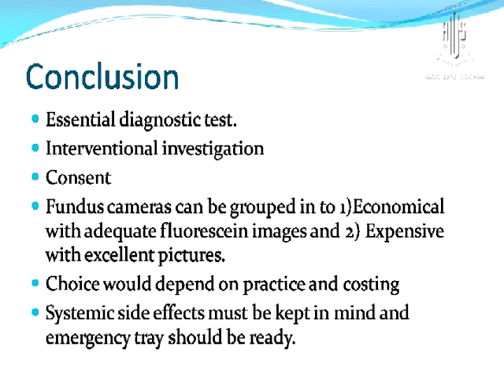So in conclusion, it's an essential diagnostic test. It's an interventional investigation. You should remember that. So an informed consent is essential in this. The fundus cameras can be grouped into an economical category and those which are expensive, but they give you excellent pictures. The choice of this would depend on your practice and the costing. So if your practice is large, then you could always go in for any camera that you'd look for. Systemic side effects must be kept in mind, and you should be ready with an emergency tray.